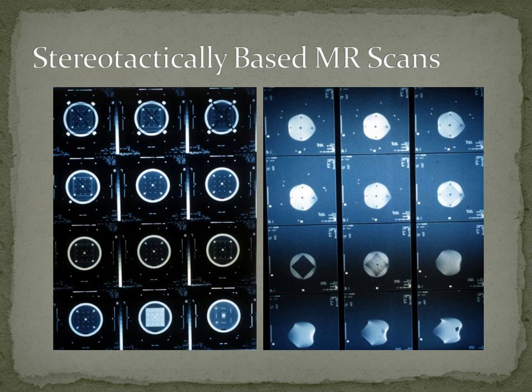What you see on the left is a CT scan of an object, and on the right is an MR scan of the same object. And again, just like that tilted gantry scan, this is much more severe than you'll ever see. If you do get a problem in an MR scan of this severity, you'll know it. The problem is what you don't see are the 2 and 3% warps. Those could lead you to 2 or 3 millimeter errors. And so having systems that don't give you the possibility of having these warped images, by not introducing stereotactic rings into an MR scanner, is a direction we decided to go in many years ago.